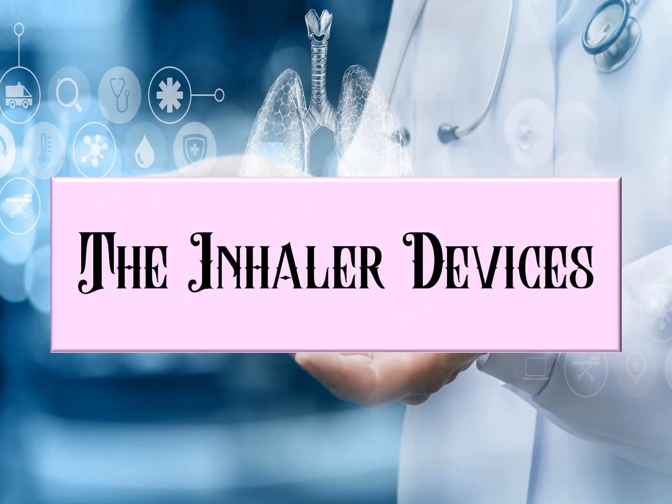Now we are at the last leg of our lecture, and this will be all about inhaler devices. Here I'm going to show you the different inhaler devices available in the market and how to use them properly. It is very important that we know how to use each and every inhaler device, because the proper use of inhalers is very important in the control of asthma.